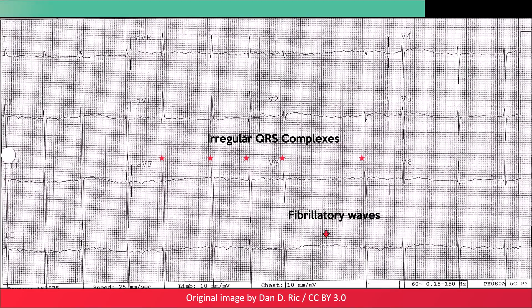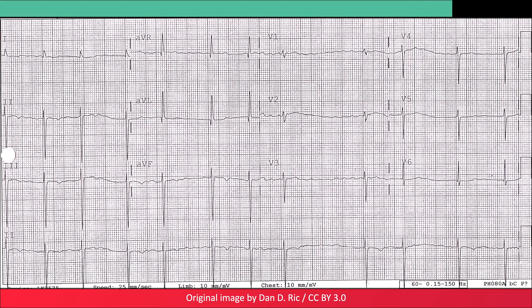In this ECG, the fibrillatory waves are not as easy to appreciate. The irregularity of the RR intervals, however, is more clearly evident. The rhythm irregularity in combination with the lack of P waves helps identify this dysrhythmia as atrial fibrillation.